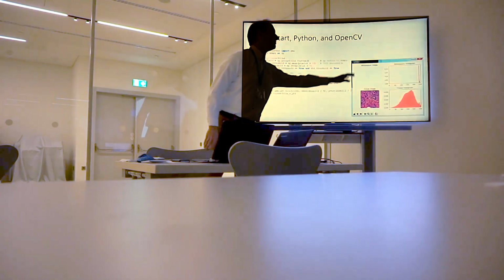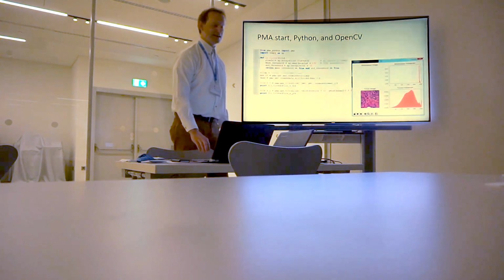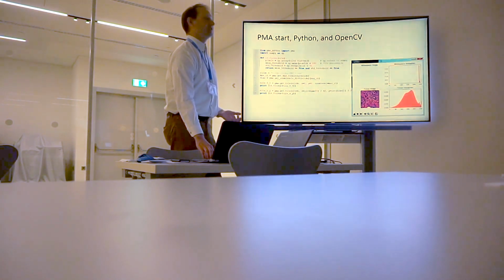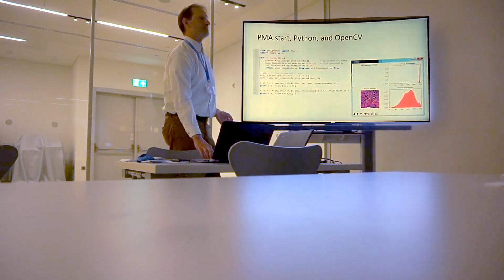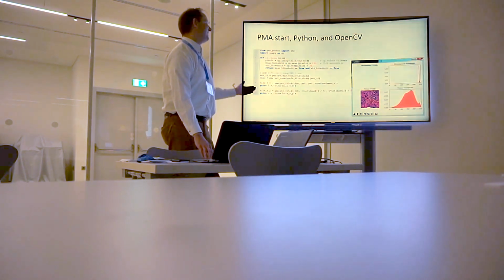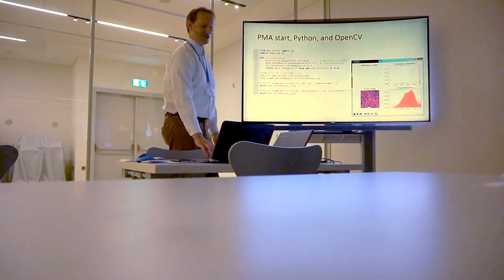And then based on that information, you can actually make a heat map of the whole slide to show where there's tissue and where there's no tissue. You're only showing regions of interest, but it's a whole image. Yeah, exactly. And that's just 18 lines of Python code in this case. So that's really neat.